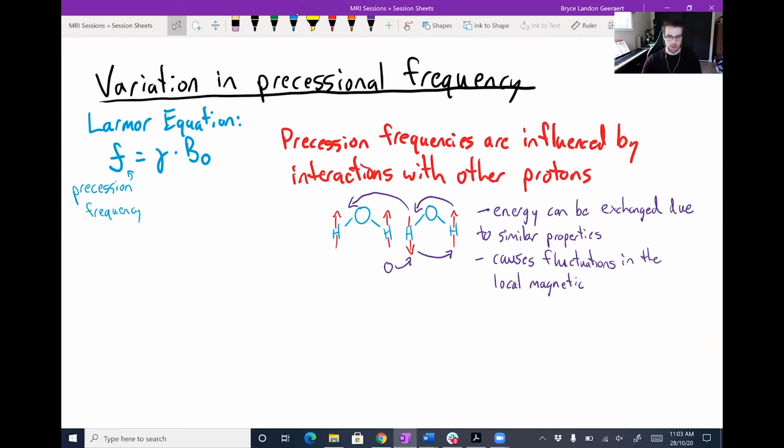Chelsea has a note about how BOLD imaging is more focused on oxygen. Yes, that's true. Oxygen is a very important molecule in how fMRI works. But what I was muttering to myself about is that in fMRI, we're still working with hydrogen atoms, and the net magnetization vector is still made up of hydrogen protons that are oriented up or down and precessing and all that stuff. Whereas if we were actually doing oxygen imaging, we would be working with oxygen atoms instead.